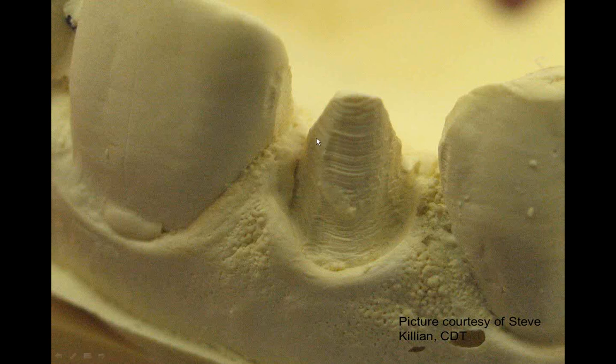We know we have a break point, an angle point. Something's not exactly as it should be, and so it needs to be brought to the attention of the doctor. Once again, this doctor is also trapping air. You can see it here and here and there and there, and of course over into here.